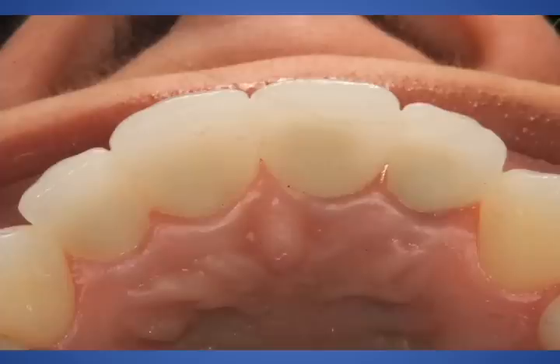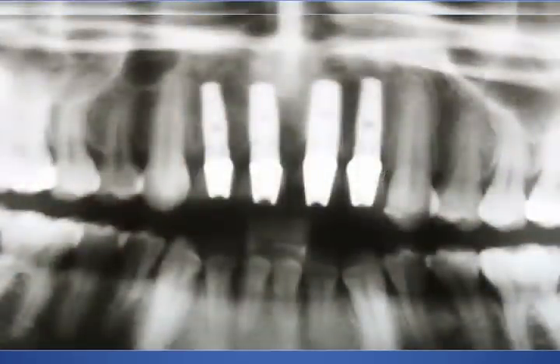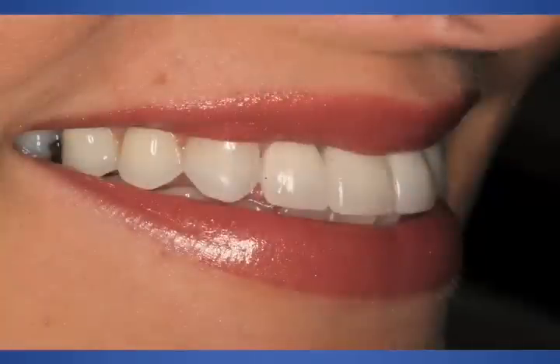An occlusal view of the same. These are 4 individual zirconia crowns. Final radiograph shows nice positioning, nice separation of the implants. We're not impinging on the natural teeth. And this was all predetermined using the CAT scan or the CT scan to diagnose and surgically place the implants.